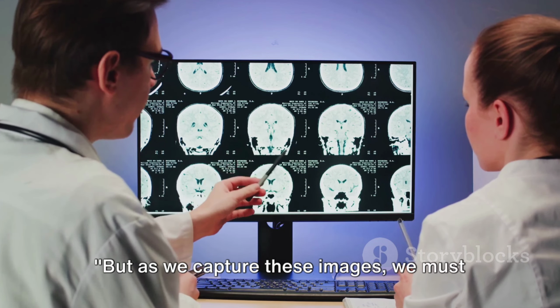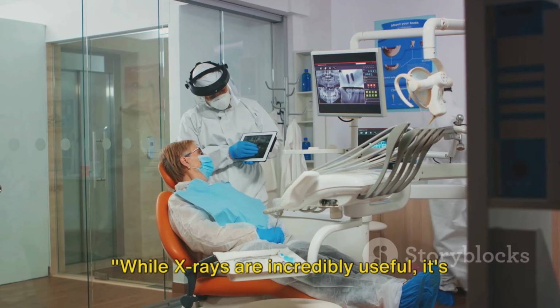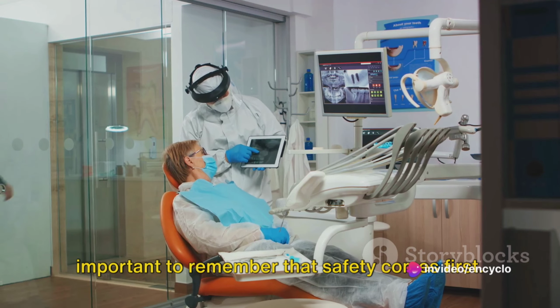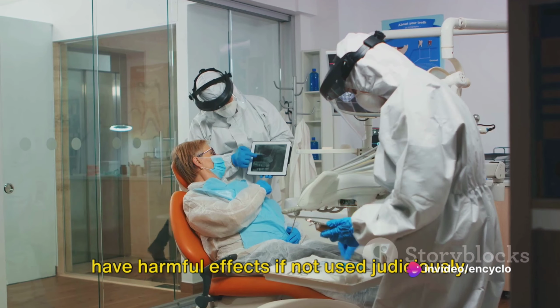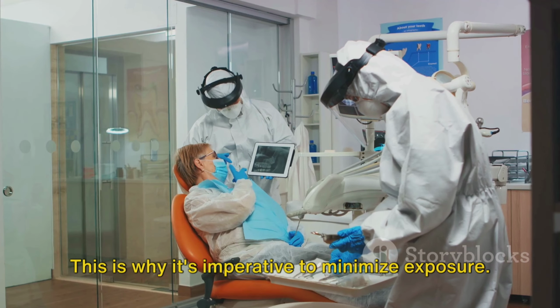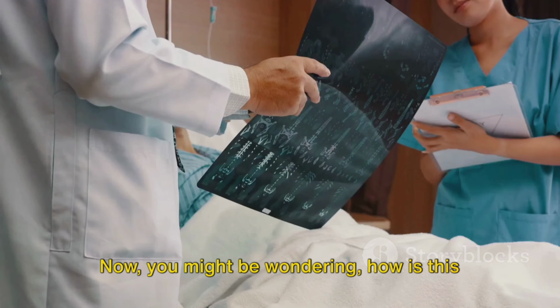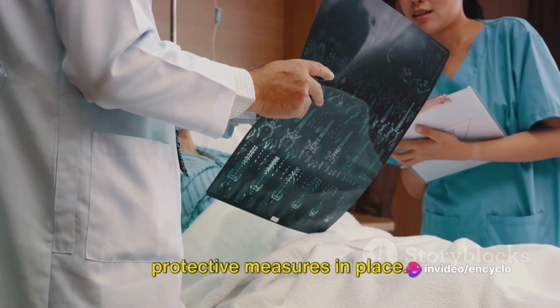But as we capture these images, we must not forget about safety. While X-rays are incredibly useful, it's important to remember that safety comes first. X-rays, like all forms of radiation, can have harmful effects if not used judiciously. This is why it's imperative to minimize exposure. Now, you might be wondering, how is this possible? Well, there are several protective measures in place.